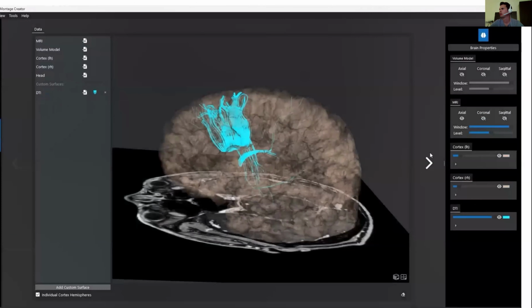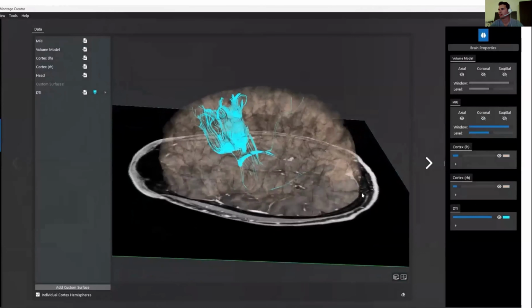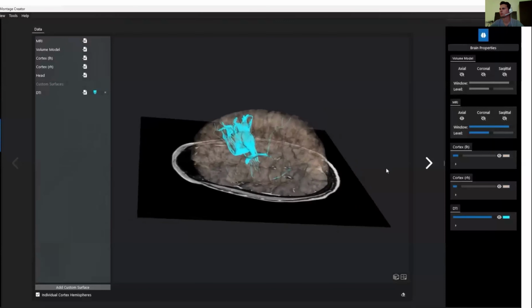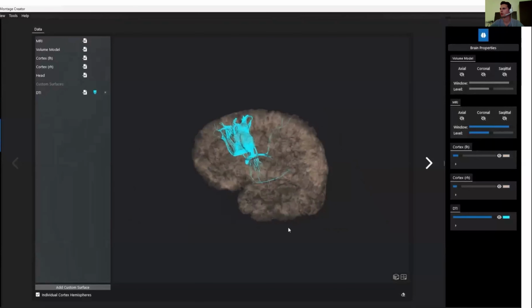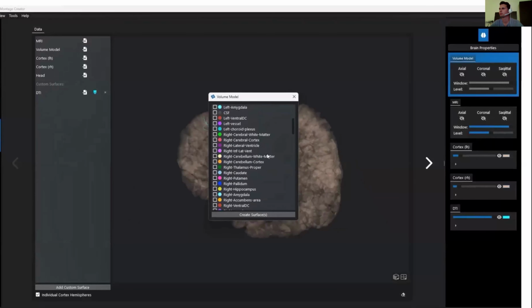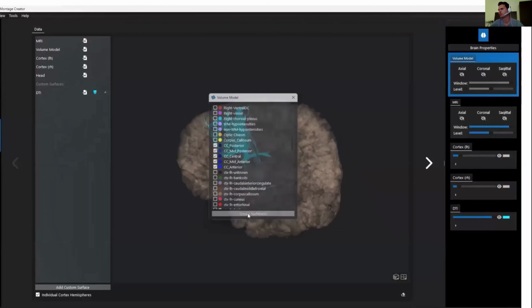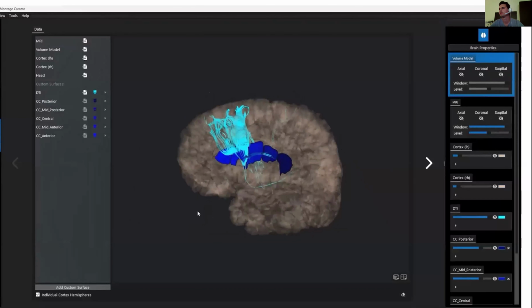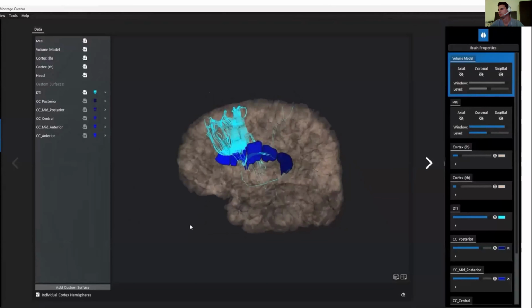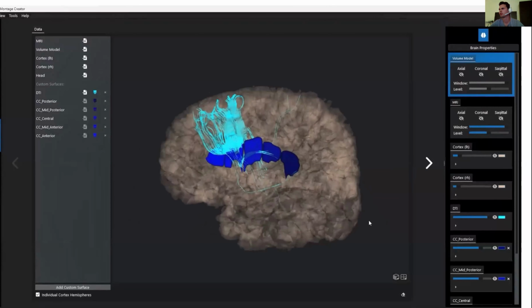And now we see the MRI, which the 3D brain is based on. So this is all provided by FreeSurfer and already available in your Montage. And we can even create subcortical regions, in that case, the 5 segments of the corpus callosum, because we want to add that to our 3D Montage.